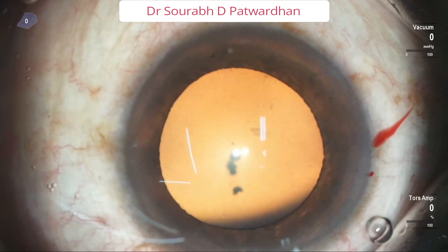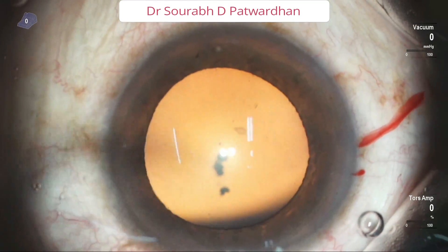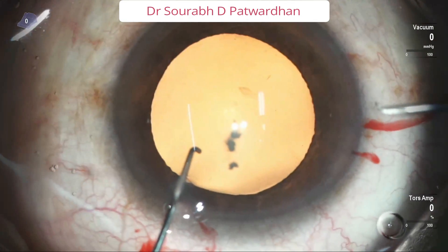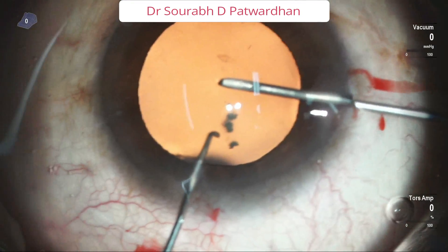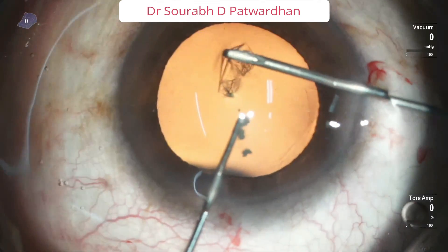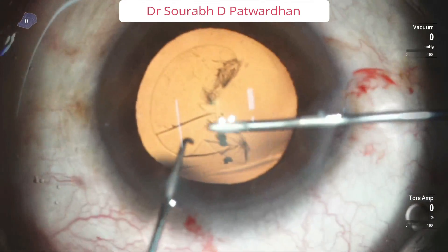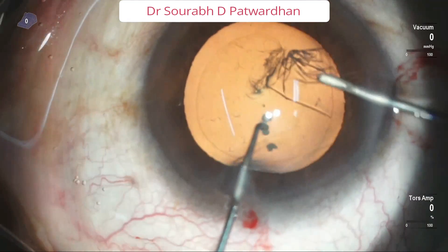The primary requisite for tackling it is to have a good CCC. I recommend at least 5mm CCC in these cases. The technique for tackling these soft cataracts is to do nucleus prolapse and then phacoaspiration, because we hardly require any energy in such cases. The only thing we require is the vacuum.